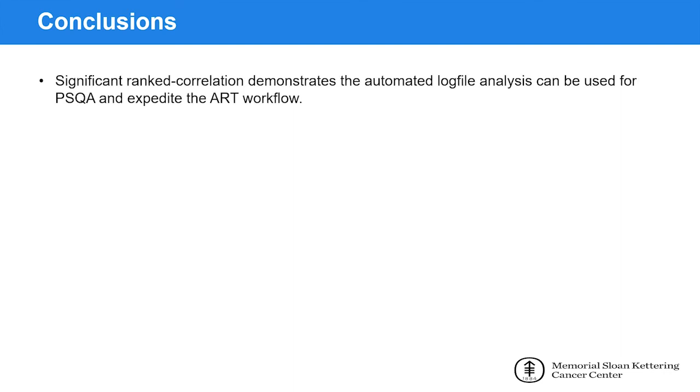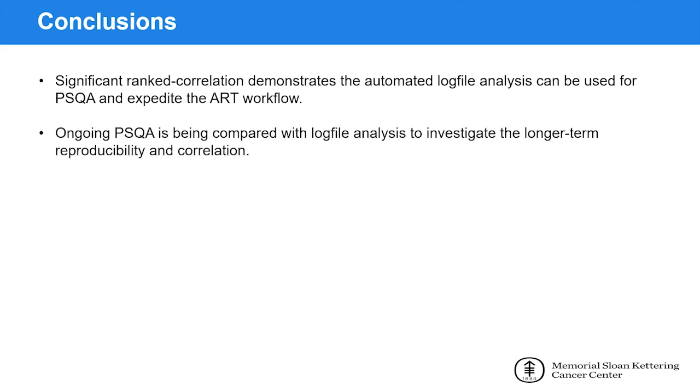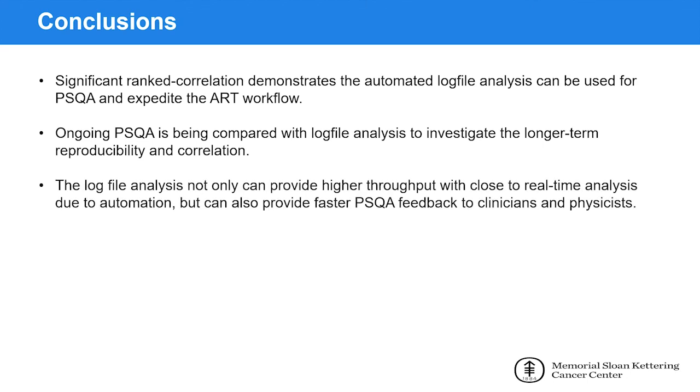In conclusion, significant rank correlation has demonstrated that the automated Logfile analysis can be used for patient-specific QA and expedite the adaptive radiation therapy workflow. Ongoing patient-specific QA is being compared with Logfile analysis to investigate the longer-term reproducibility and correlation. The Logfile analysis not only can provide high throughput with close to real-time analysis because of automation, but can also provide faster patient-specific QA feedback to clinicians and physicists.